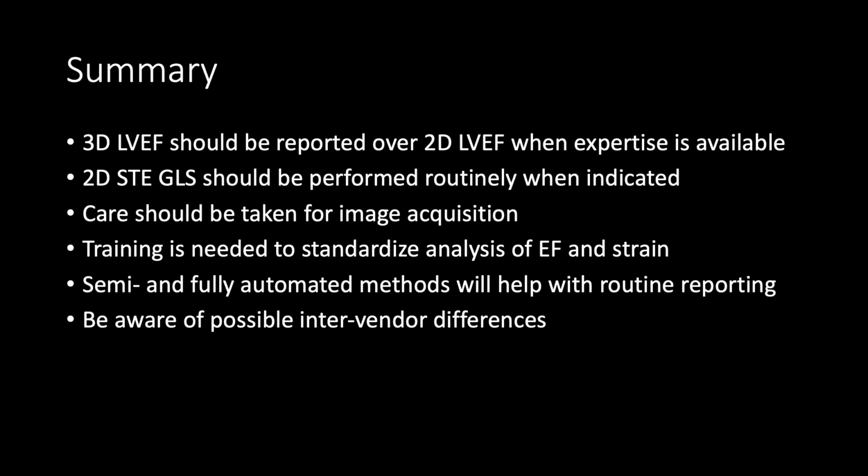In summary, 3D LVEF should be reported over 2D LVEF when expertise is available. 2D speckle tracking global longitudinal strain should be performed routinely when indicated. Care should be taken for both 2D and 3D volumetric and strain analysis during image acquisition. Training is needed to standardize analysis of ejection fraction and strain. Semi- and fully automated methods will help with routine reporting and improving reproducibility. One of the things you have to be aware of is possible inter-vendor differences, and at this time it's probably recommended to use the same vendor for serial analysis.